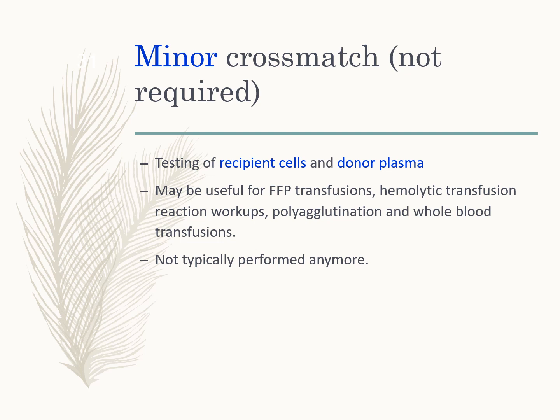So the minor crossmatch, just so you know the history, it's the opposite. It's testing the recipient cells with the donor plasma. So it could be helpful in FFP transfusions or hemolytic transfusion reaction workups, but it's not typically performed. I don't think I've ever seen anyone perform one.